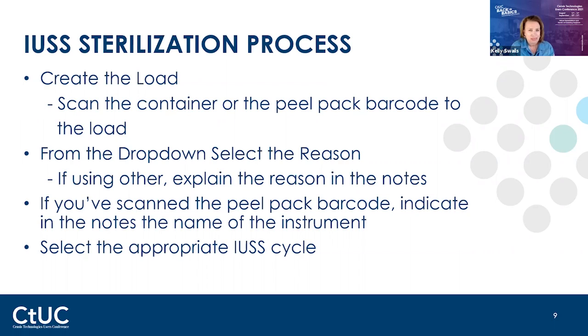Because some of those aren't as easy, like our rectal tray for those surgeries. Some were not as easy, and I really had to dig. I really had to look through and say, why? And if it was a reason that was just not valid, I brought it right to the OR leadership and said, "Hey, this was done yesterday and there's no reason for it. They didn't even look, this instrument's in these sets. They didn't even ask us." So it's just really spending that time and drilling down.